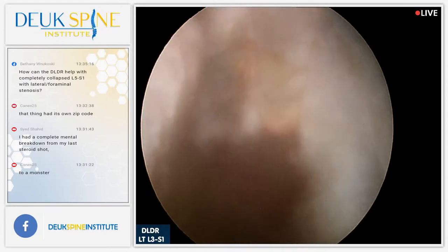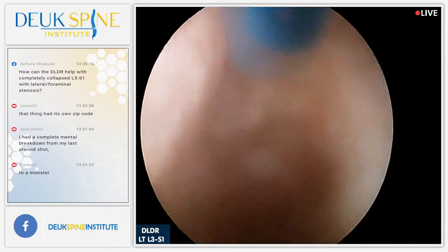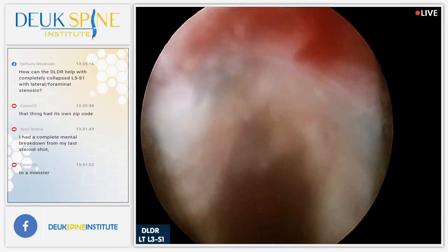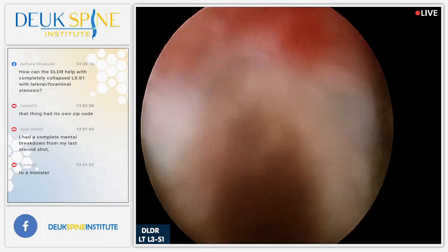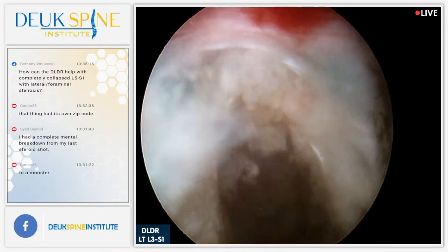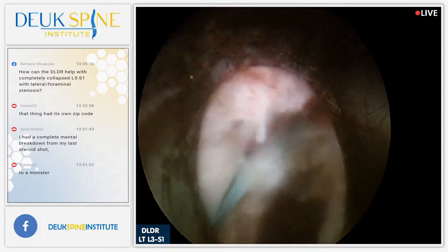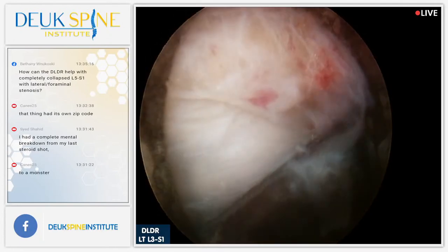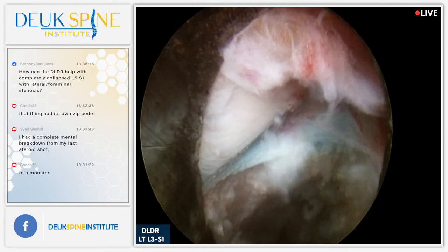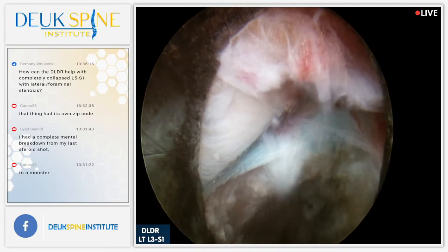Luis, any thoughts? You happy? I'm happy. Let's show our audience the nerve root in the foramen. Okay, laser off, grabber. I'm going to show you guys the L5 nerve root. All right, the L5 nerve root is right there. You see it? Okay, so, hey, Henry, another great picture. Ready? Take a picture right there.